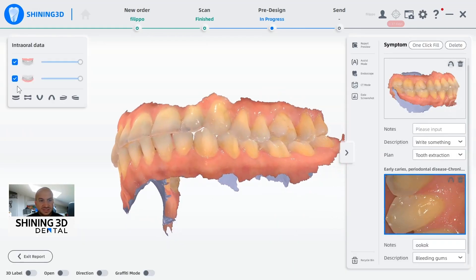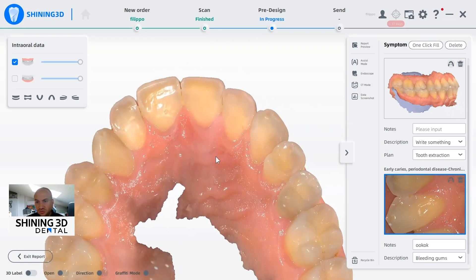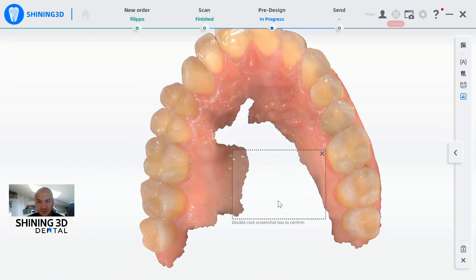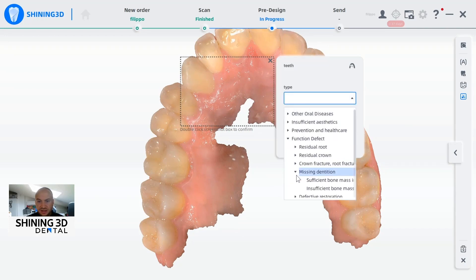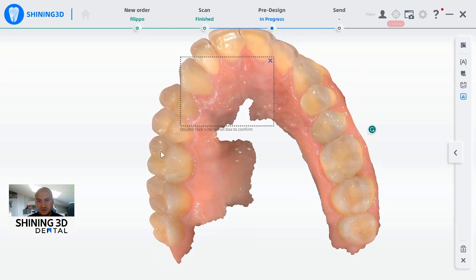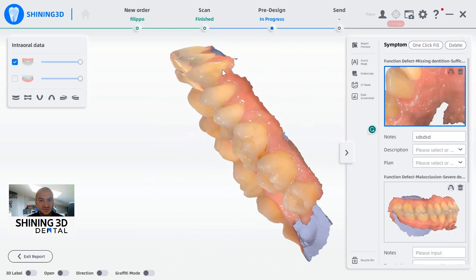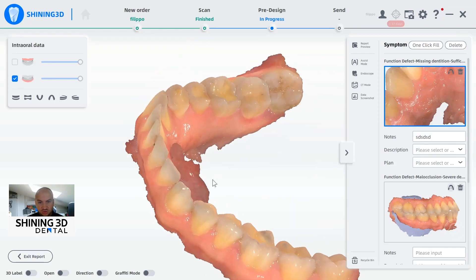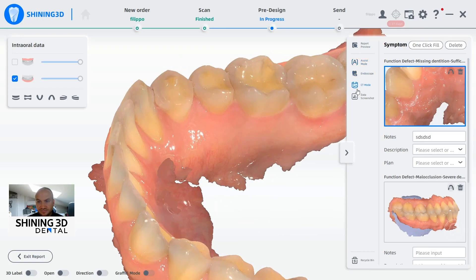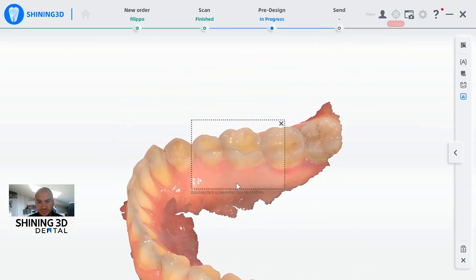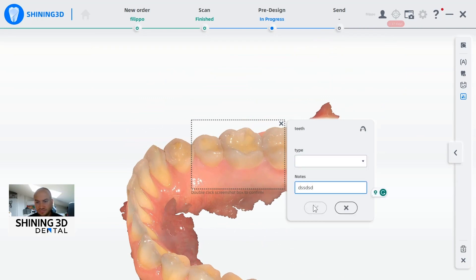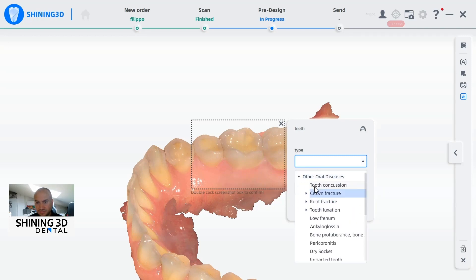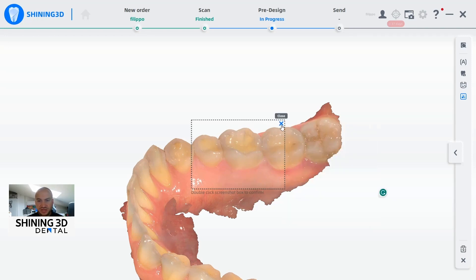As in the previous version, we still have the possibility to make a screenshot directly from the 3D model. We can double click, and also here we can select between the different functions and write something in order to highlight something really specific — also in this case to improve the communication with the patient. Let's take a screenshot with a double click, just to make an example.